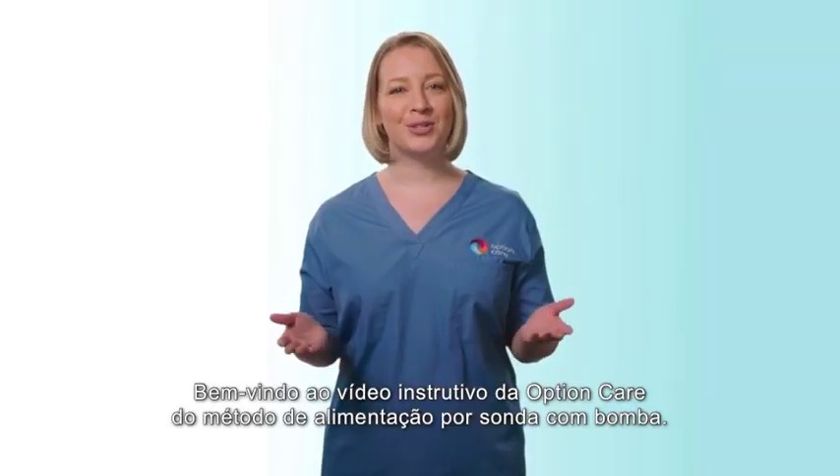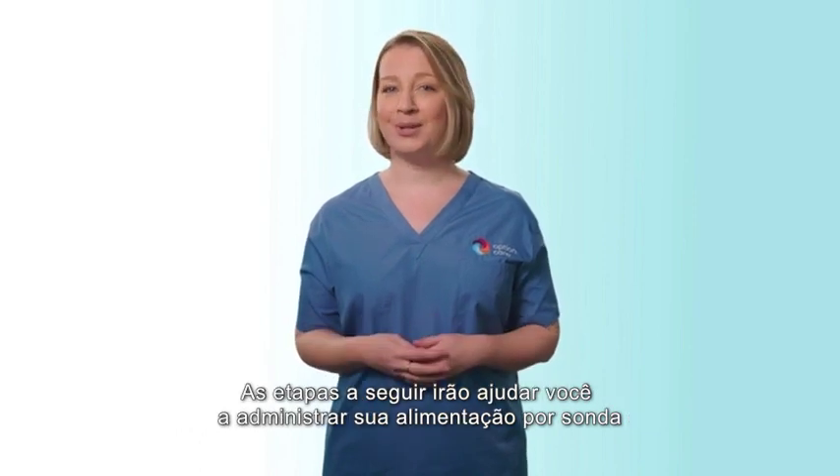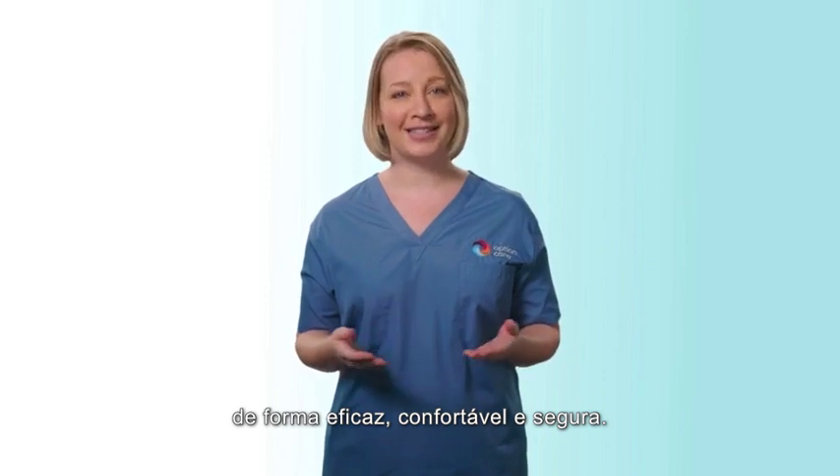Welcome to Option Care's Tube Feeding by Pump Method instructional video. The following steps will help you administer your tube feeding effectively, comfortably, and safely.